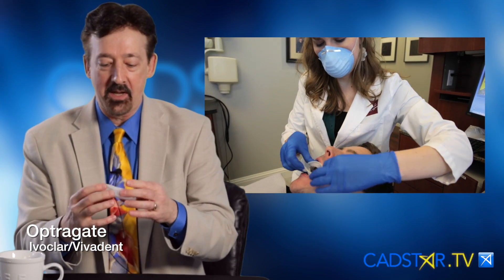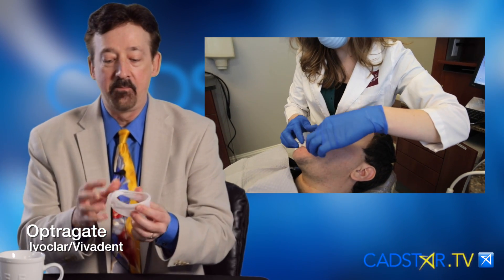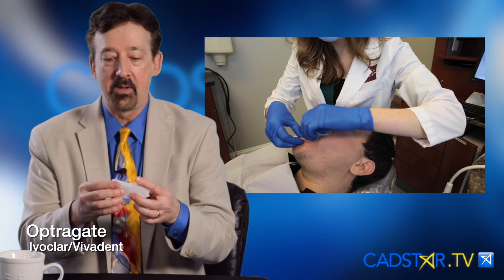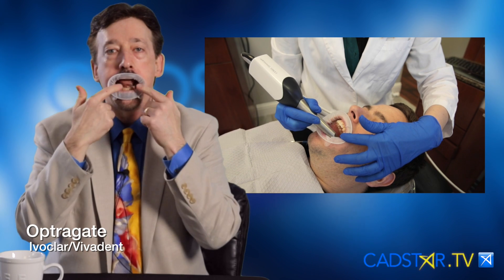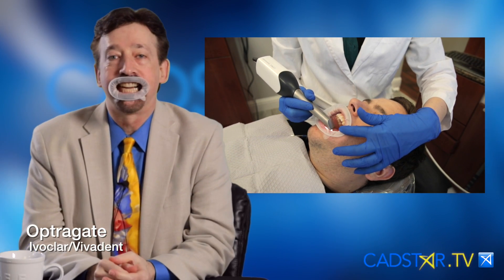Number one is the OptraGate. I just love this thing. The most important thing is when you're placing it in, there's an inner and outer rim. You want to compress the inner rim, go behind the lips, and then you're locking it just right.